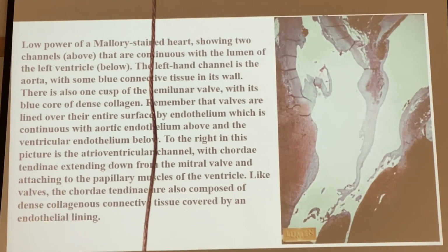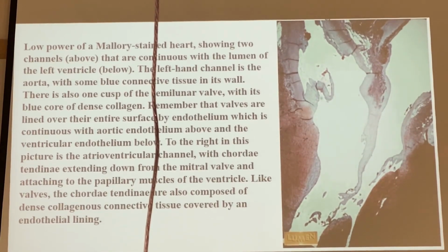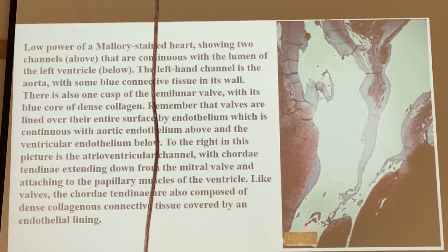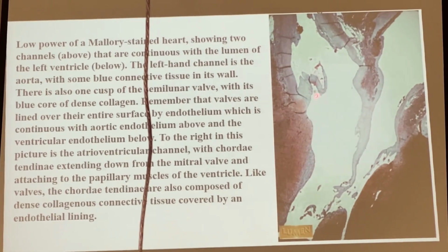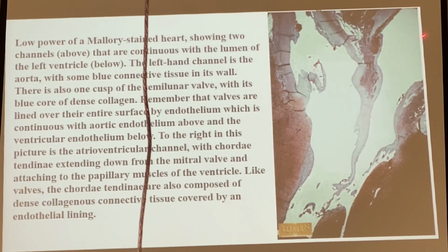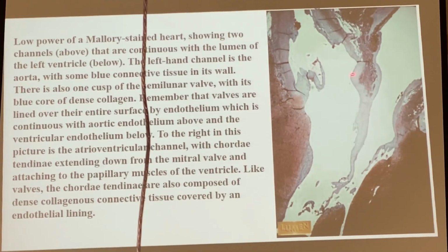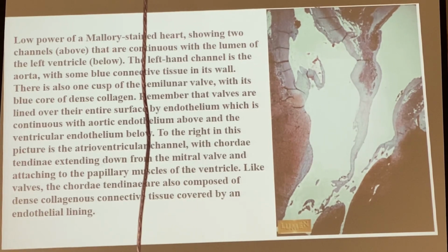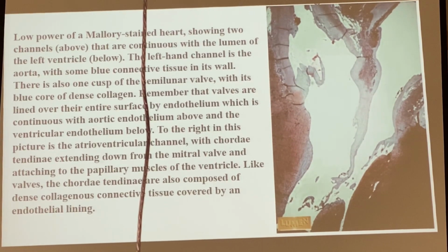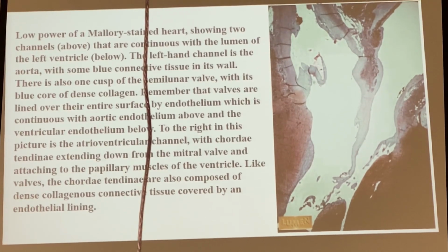Is this section clear to you? This is the left ventricle opening into the aorta, and this is the atrioventricular opening of the left atrium into the left ventricle, and that's the valve which guards this atrioventricular orifice.